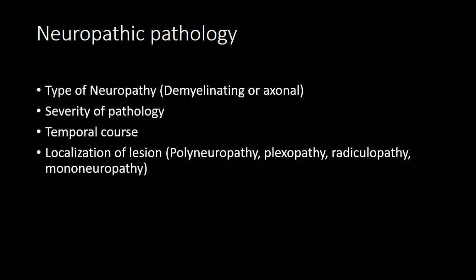Then comes the point that I need to repeat only this study again, because it's a separate question to be addressed, to know the severity of the pathology and to give a localization of where the surgeon is going to go in. That's the same way when a patient has a neck problem, like a cervical radiculopathy question or a lumbosacral radiculopathy question. You tend to do these studies before the surgery so you can quantitate how much improvement there is. Did something new happen after the surgery? Or is it the same pathology ongoing?